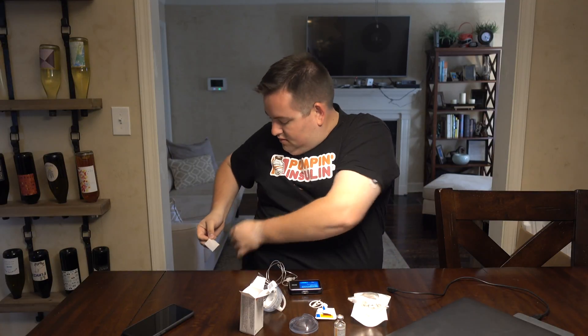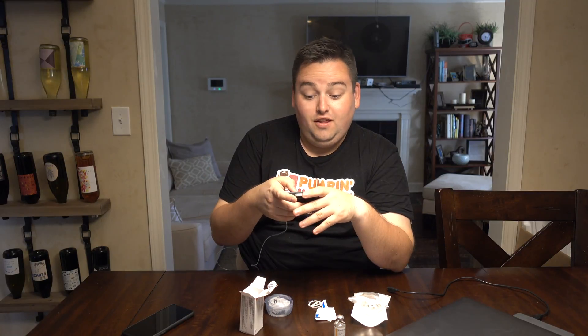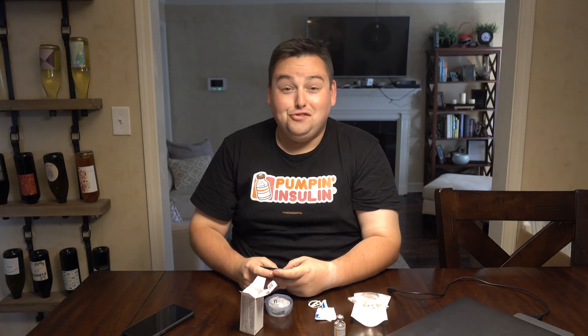We actually use the site prep since I forget so often. Fill cannula. Sorry I sound horrible — it's allergy season here in Georgia and this is what I'm going to sound like for the next month. We are back up and running.